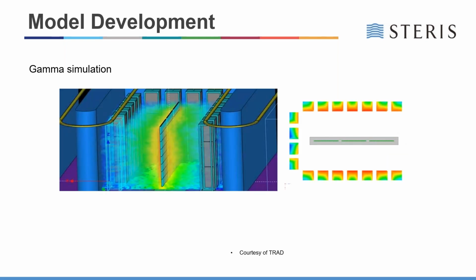Okay, next we have several slides with graphics, courtesy of TRAD, the maker of RayXpert. And these graphics showcase the data collection experience that's derived with radiation simulation. You can see in this first graphic, this depicts an example single pass cobalt irradiator. A cross-sectional view on the right-hand side shows how this dose distribution would be varied based on the position within the bunker.